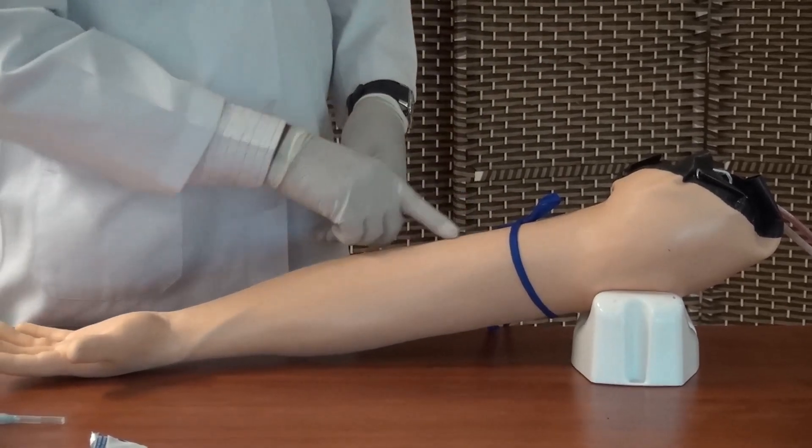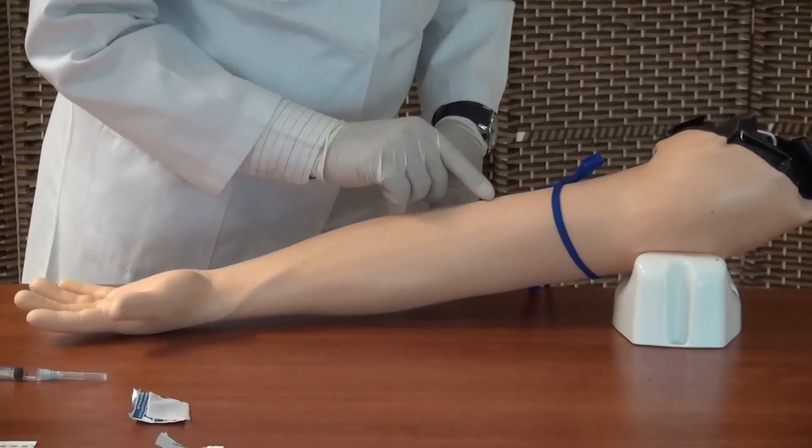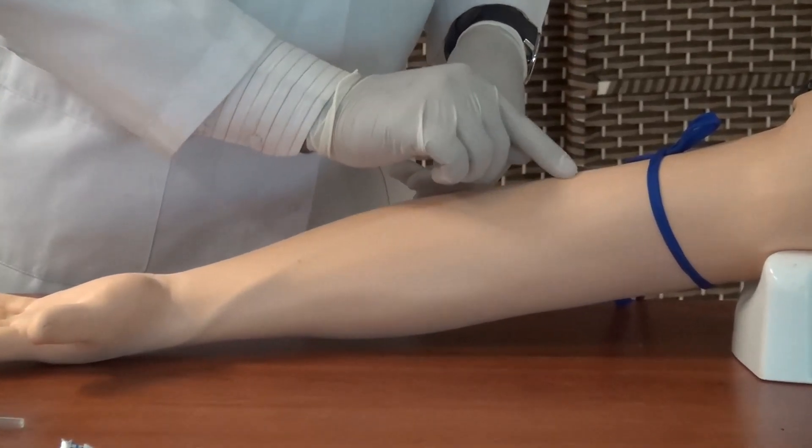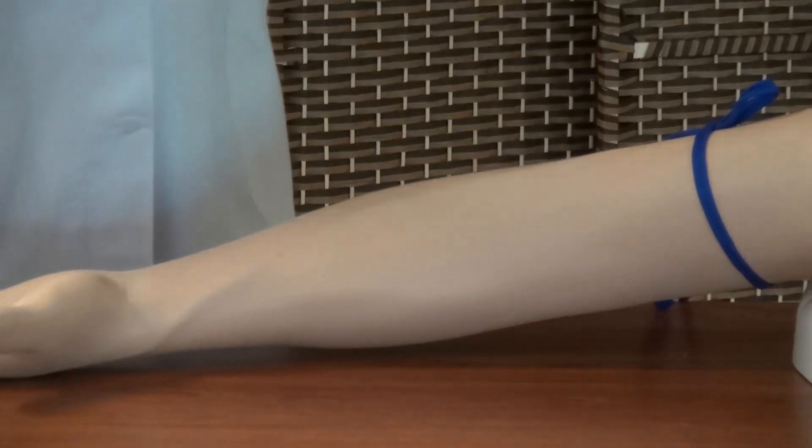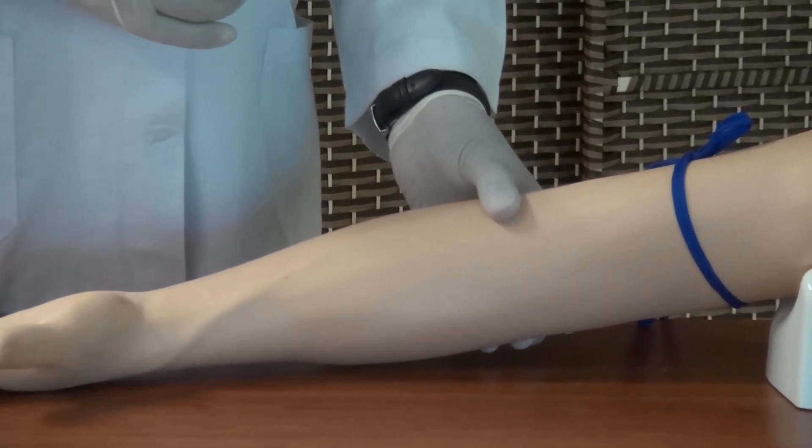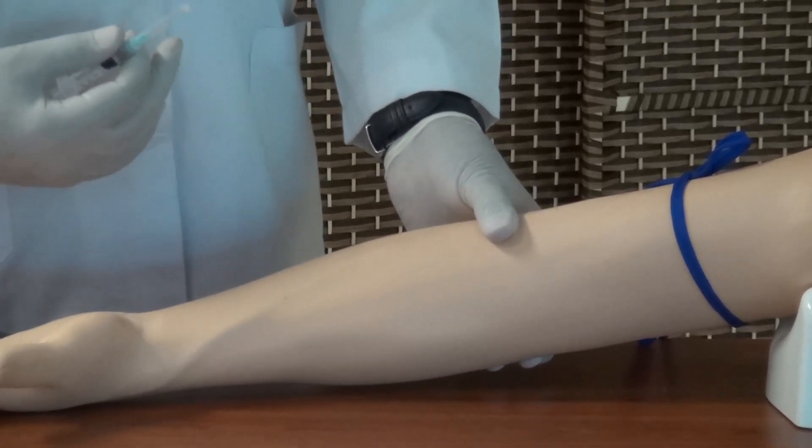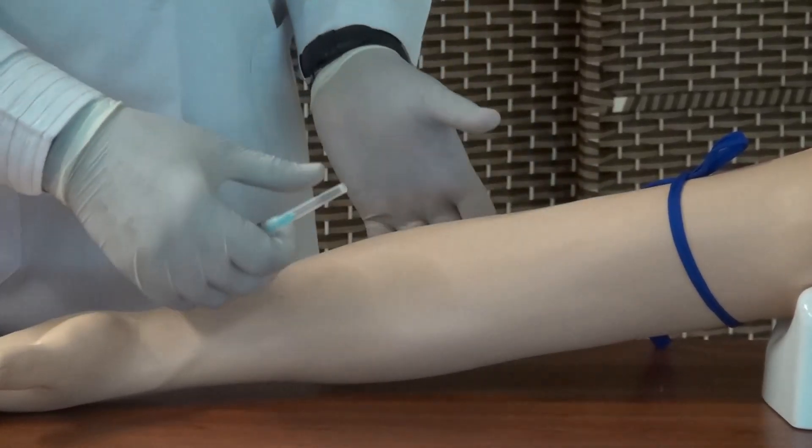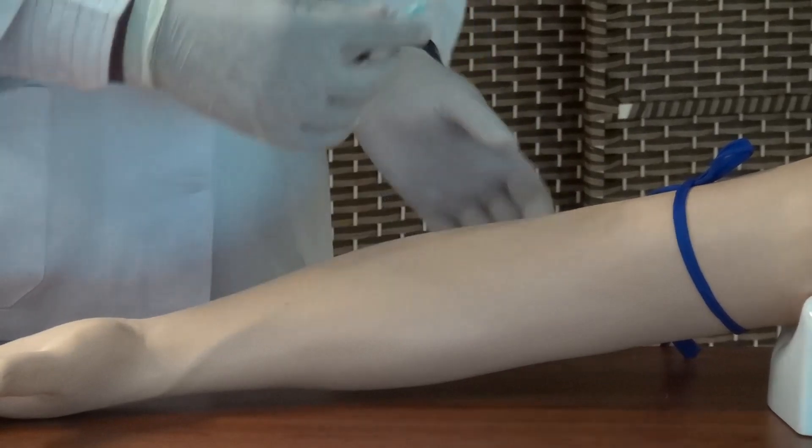Allow a few seconds so that the vein in the arm gets engorged. After a few seconds, if you try to locate, the vein is pretty obvious. You can palpate the vein if you like, and if you think it's not easily located, then it's always a good idea if you fix or stabilize the skin or the vein. Try to give gentle traction along the longitudinal axis of the vein so that the skin and the fascia or the vein, because they are superficial veins, they will be fixed and they won't move. The rolling under the skin will be prevented, so it will be an easy entry then.